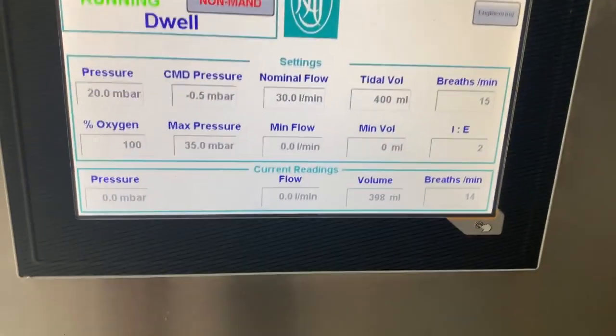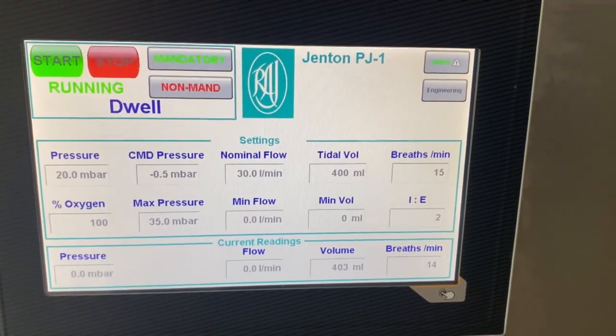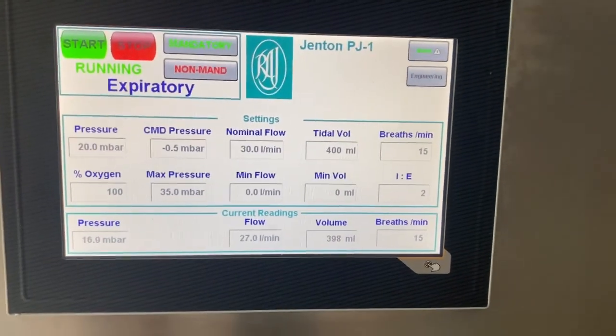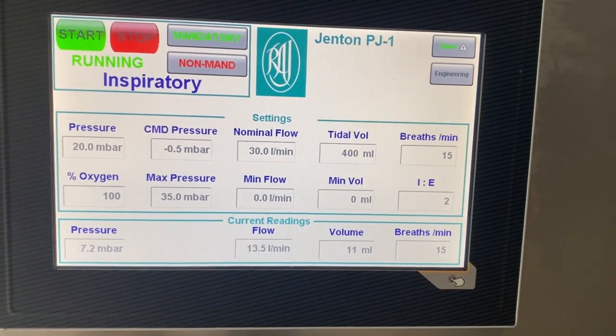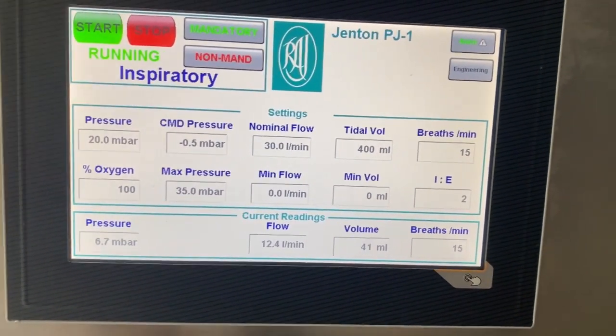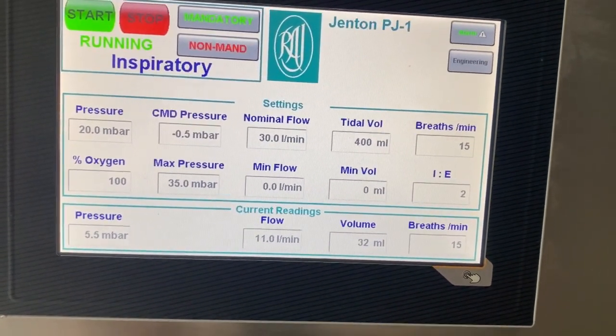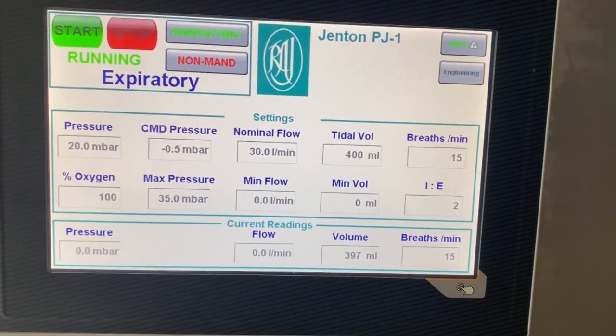Looking at the HMI, the interface has been designed to be clear and concise with the frequently used settings directly available to the clinician. As would be expected, there are set points for flow rate, tidal volume, IE ratio, maximum back pressure and O2 concentration, along with instantaneous readouts of the current values.